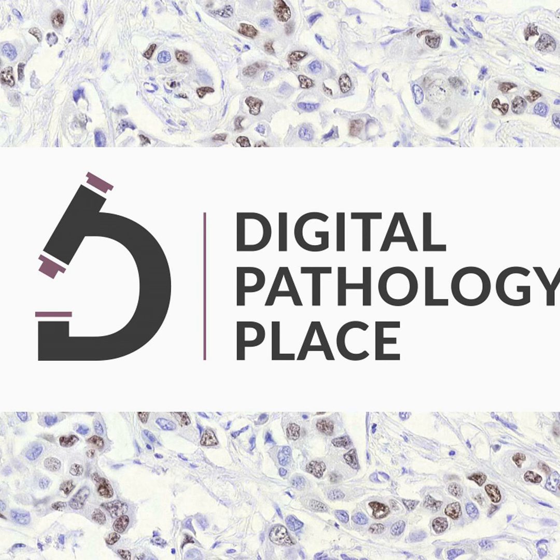But long story short, you retain glass. Now you're doing your job on digital images. Yes, you retain digital images. And what do they say about this? They say that if whole slide images are assessed in lieu of original glass slides, so if you're now doing your job on digital, then yes, you have to retain them.